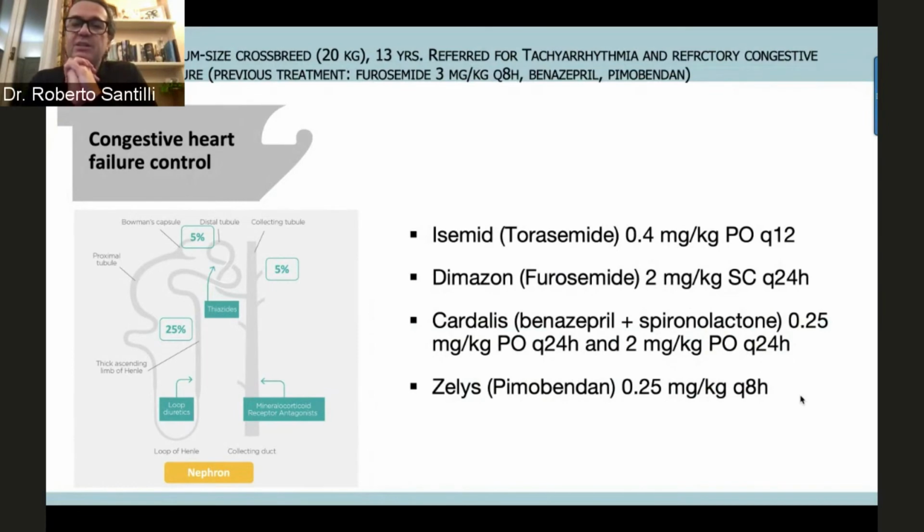In our studies that we published in 2018, of I think more than 85 accessory pathways, just one of them had only antegrade conduction. The remaining 99% of the accessory pathways also have retrograde conduction, so reciprocating tachycardia. So it's very important to remember that when you have pre-excitation, you need to be sure whether you also have reciprocating tachycardia, and that's the one that I need to treat. So it's the reciprocating tachycardia, not the pre-excitation by itself.